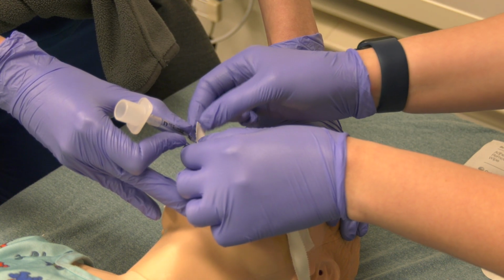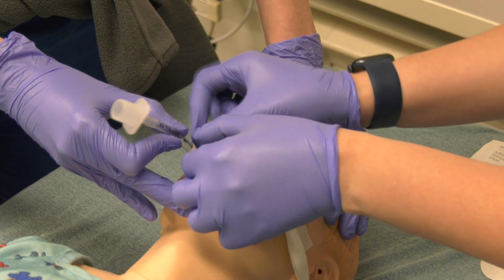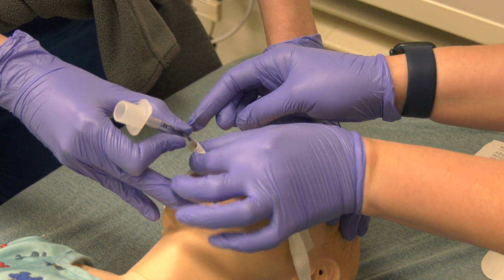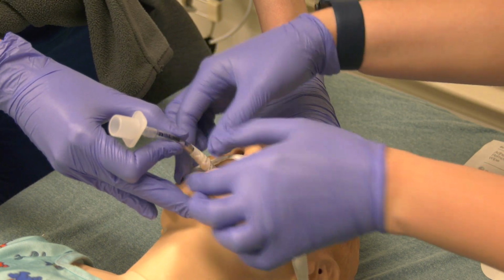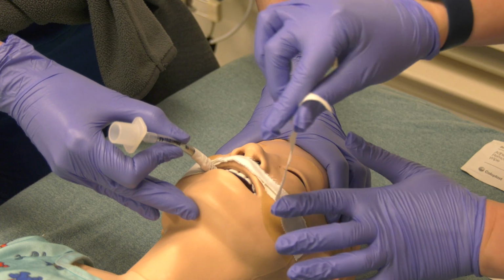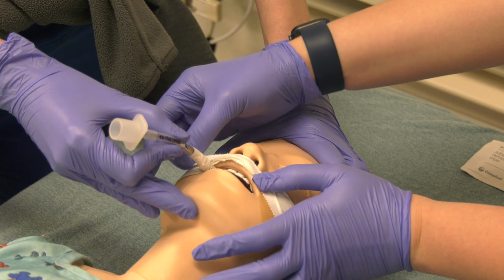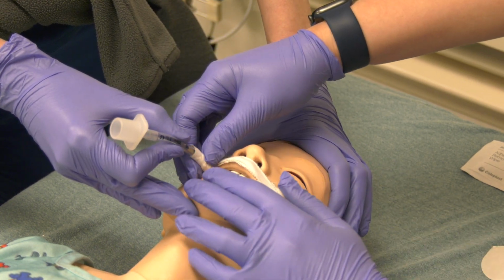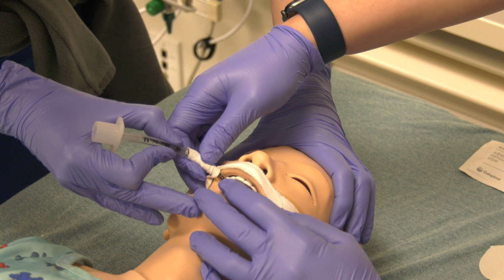And then you will dog ear this piece as well. Once you can use your hands to make sure that it's completely adhered to the tube. And then press this down with your finger. And then both look at the tube and make sure you're still at 14 at the teeth.